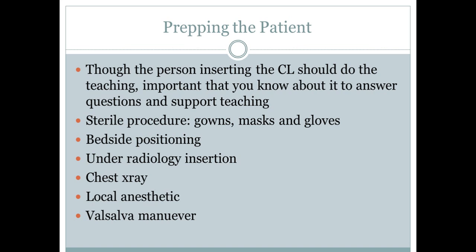One thing that we'll be talking a lot about, especially when you do any manipulation or cap changes or flushes, is to have that patient do the Valsalva maneuver. What that's going to do is help put some pressure on that, so you'll have a decreased risk of air emboli being introduced in that tubing. And if we all remember from nursing school, the Valsalva maneuver is kind of like bearing down or holding the breath.